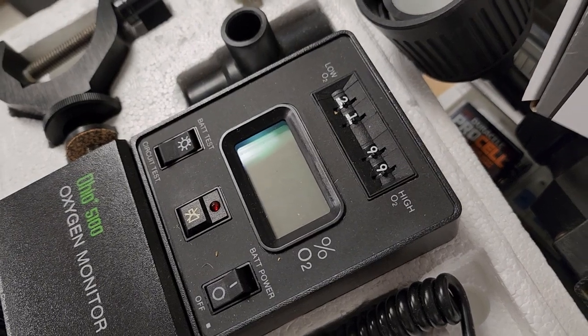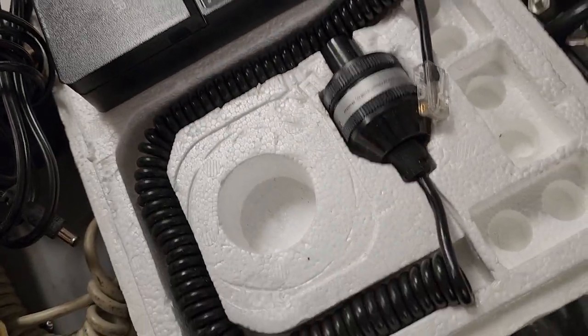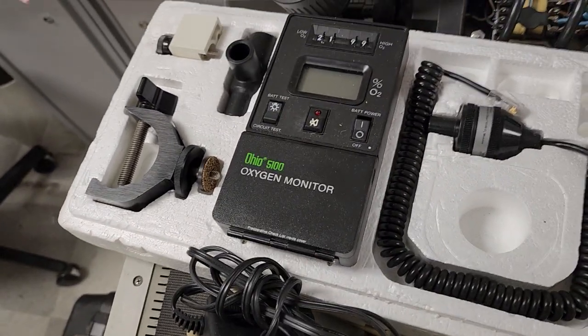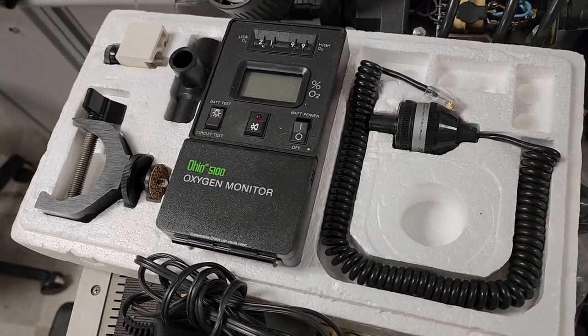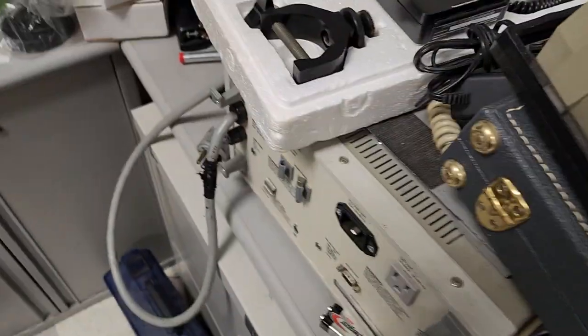Check out this oxygen monitor — Ohio 5100. You set your low and the high with analog flip gauges at the top, and it runs off battery power. You have an auxiliary O2 cell that plugs in — it comes as a kit. Look at this, it looks like it's brand new in the box. Win!